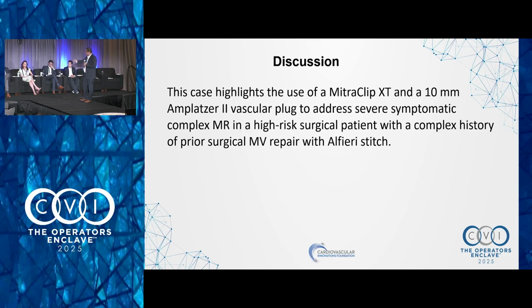Or a 10 millimeter plug. So, the space to get the clip in and out, we probably could do an NT, I think. NT or a P5 would work fine. But that was 2020 as well. So, okay, thank you.